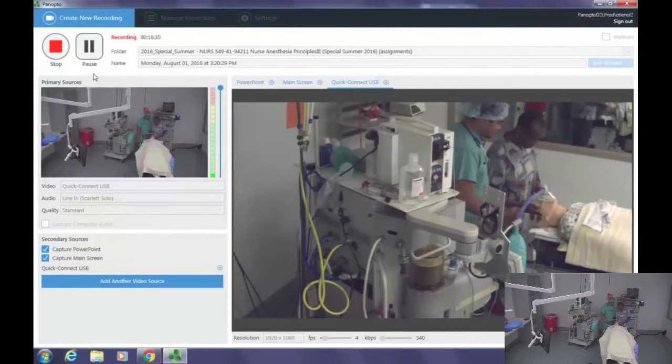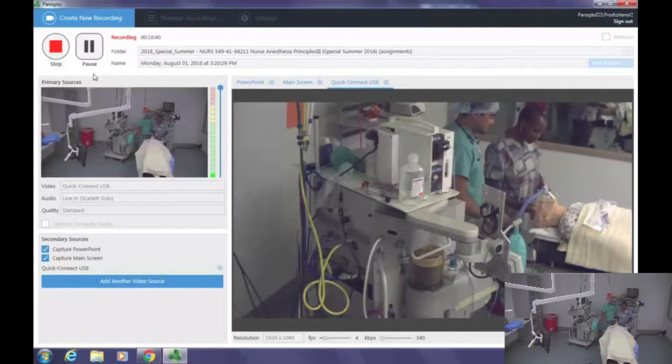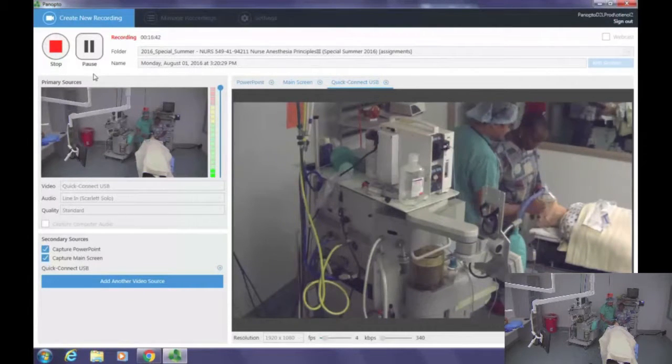Mr. Judy, how are you doing? Mr. Judy is still not asleep. Keep your eyes open. Can you open your eyes for us? We just want to wait for Mr. Judy to sleep. Mr. Judy, can you open your eyes? Mr. Judy is now asleep. I'm going to check for eye reflex, and he doesn't have any eye reflex.